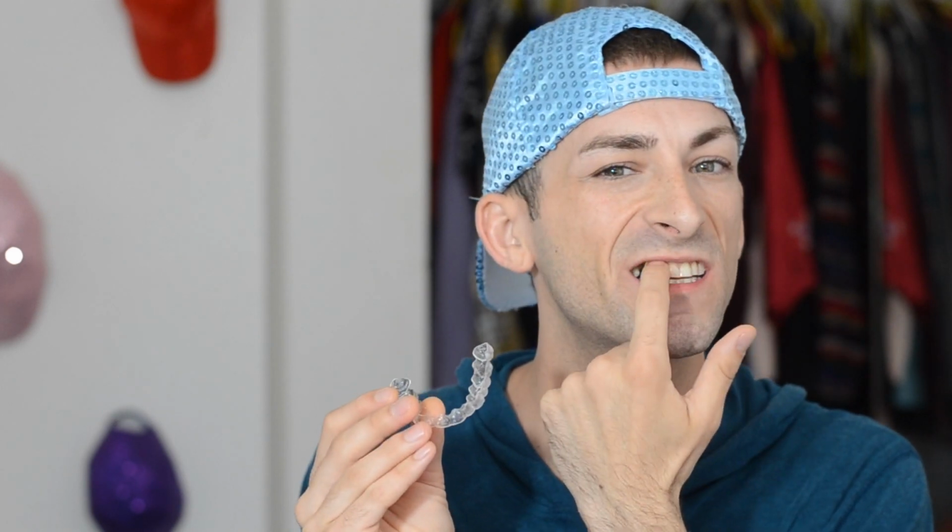So I just left the orthodontist literally a couple hours ago, and I am currently starting week 18 in my trays today. So this is my 18th tray right here. Just going to pop it in. And no, they don't go in as easily as a retainer. You literally have to fit it around the attachments, which are like these glued on dots to your teeth.